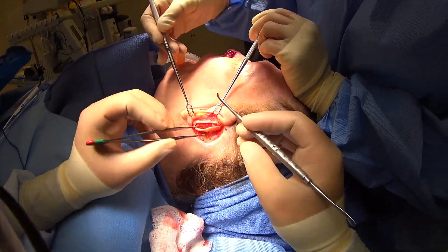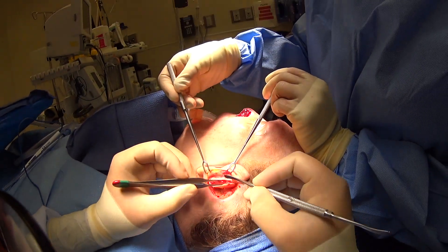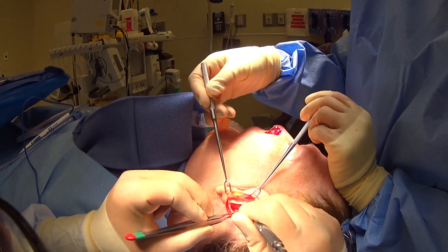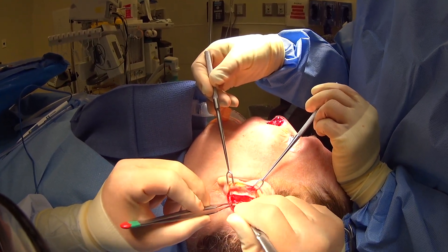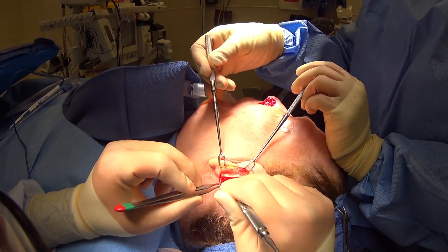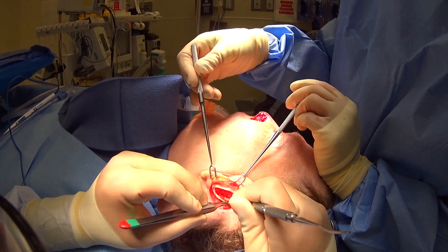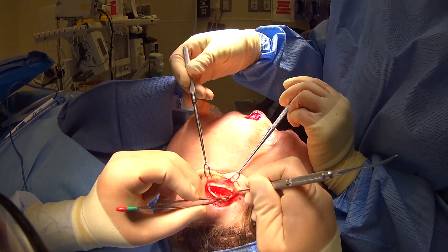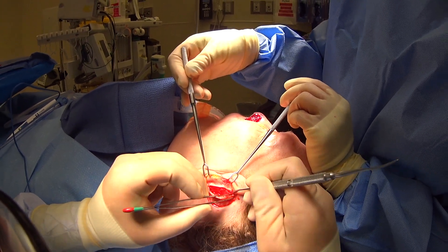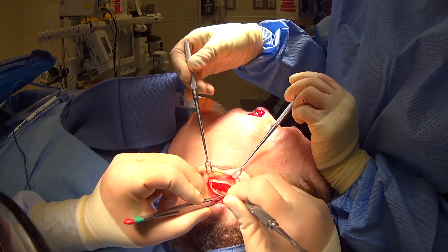Here you can see we've made our incision in the back of the ear and exposed our cartilage. It's a little longer than our defect, but we do that so we can tuck it in. We can actually just peel this cartilage off the skin — this is the anterior skin here, our posterior skin is folded up — just slowly peeling all this off. We almost have more cartilage than we need because the ear won't miss it, and it gives us plenty of room to shape the nose however we need.